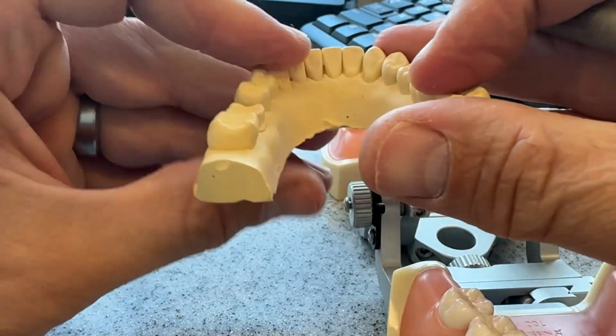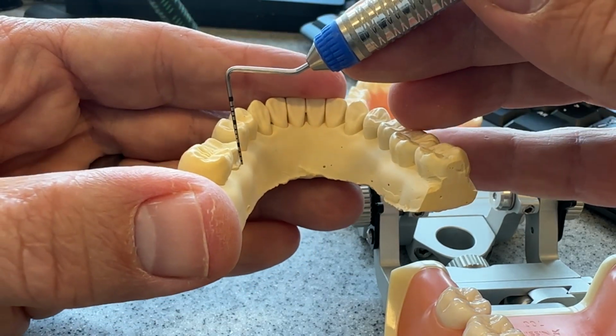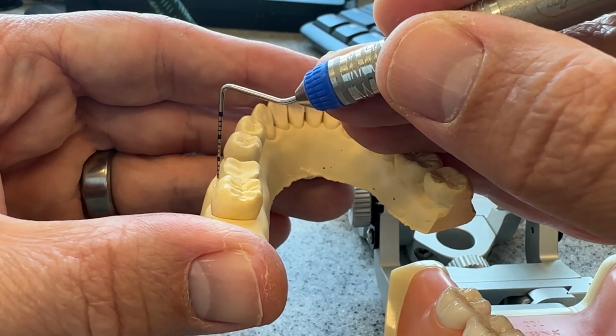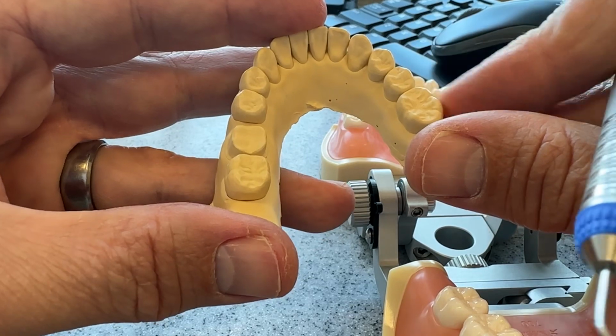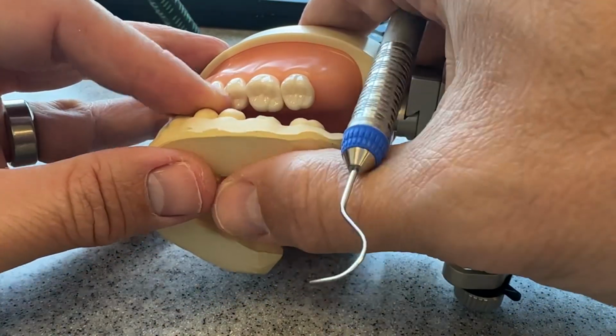Okay, what you want to avoid is over tapering your lingual towards the buccal and then having your buccal straight up and down. That'll shift your tooth to the buccal and is going to cause you some problems on the rest of your prep.